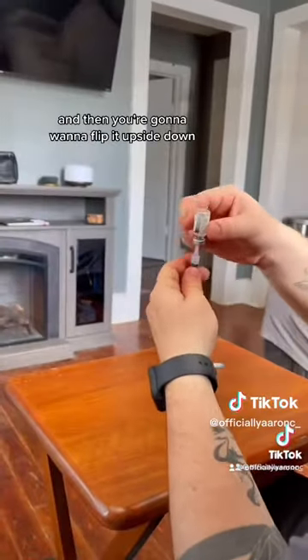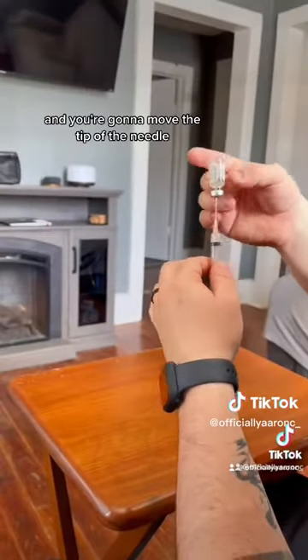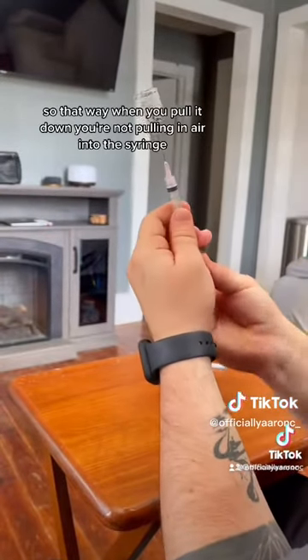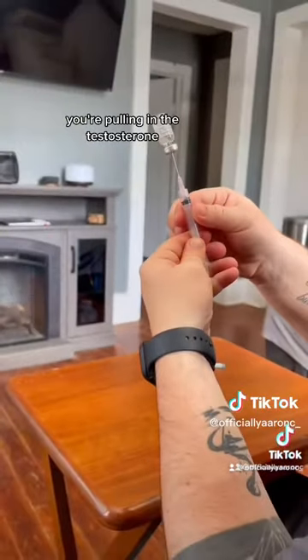Then you're going to put it upside down so you can see the liquid at the bottom of the vial, and you're going to move the tip of the needle to where it's submerged in the liquid. That way when you pull it down, you're not pulling air into the syringe — you're pulling in the testosterone.